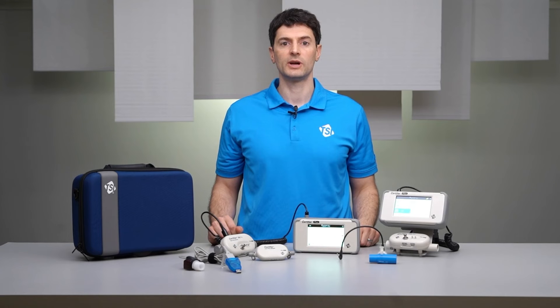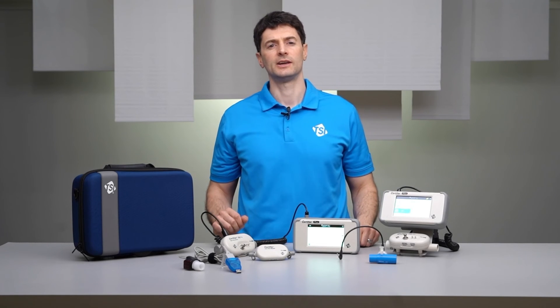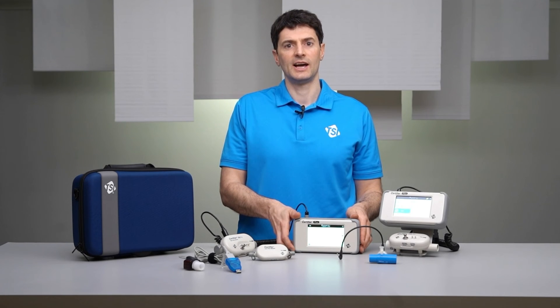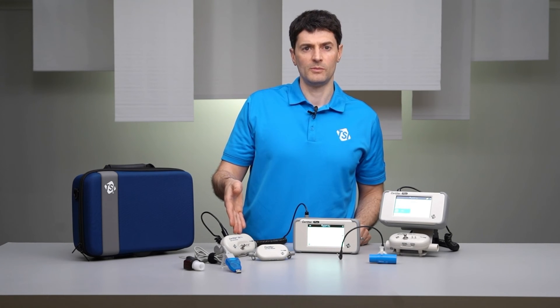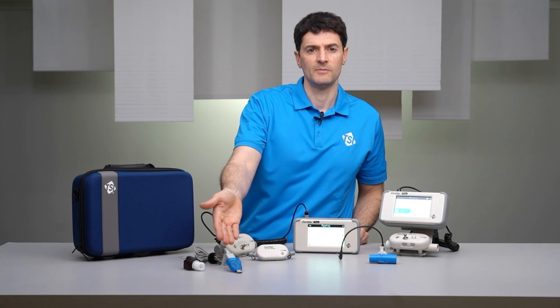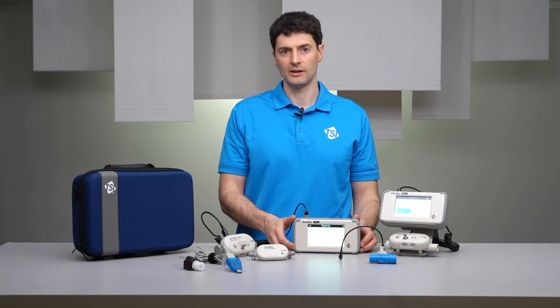TSI recommends an annual calibration for the Certifier Plus high flow and low flow modules. Note that only TSI can adjust the sensor calibration of TSI flow instruments; third-party labs can only do a verification check. The certifier interface module does not contain any sensors and does not need to be sent to TSI for calibration. This means while you're calibrating one of your flow modules, you can connect a different flow module to your interface and avoid any testing downtime. The oxygen sensor and the anesthesia sensor are zeroed by users in the field daily or on an as-needed basis, and TSI does not calibrate either of these sensors.